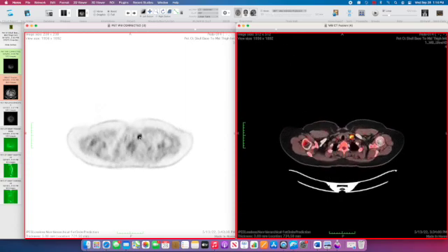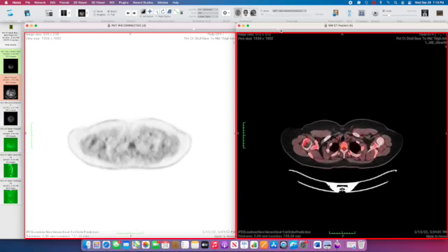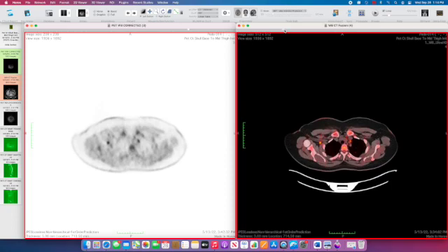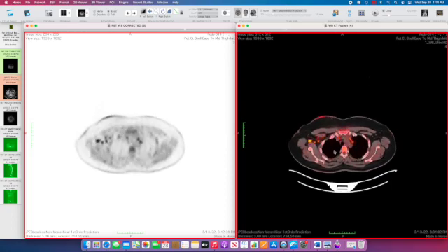Here these are pretty intensely hypermetabolic and a little bit enlarged. As we scroll down through the chest, we see many additional lymph nodes in the mediastinum next to the aorta and in the axilla, more so on the right.